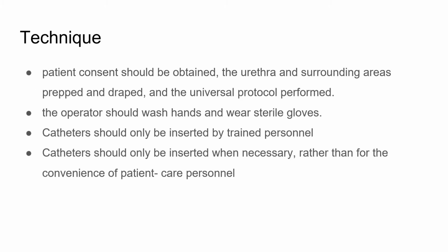So now moving on with the method or the technique that is adopted for the catheterization. As a part of the pre-operative procedure, that is prior to the urinary catheterization, patient consent should be obtained. The urethra and the surrounding areas are prepared and draped as per universal protocol. So all the surgical preoperative draping procedure is also followed here.